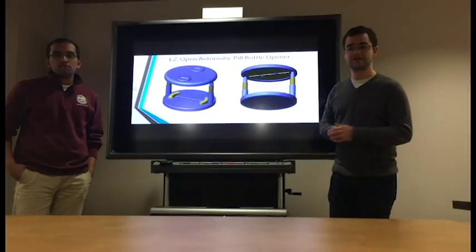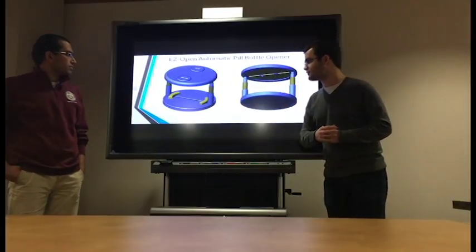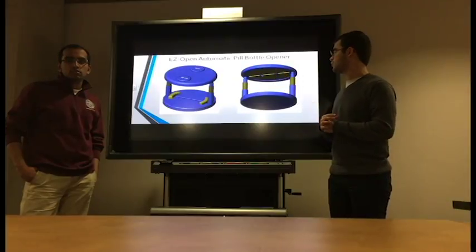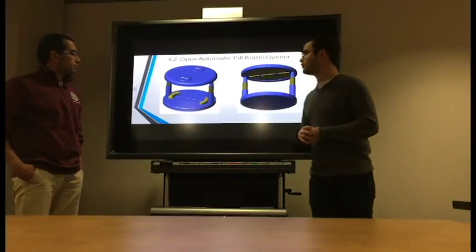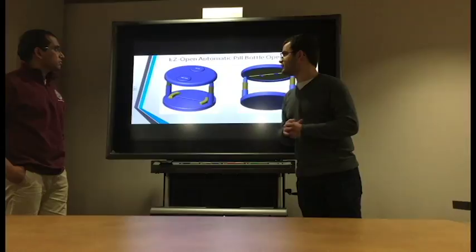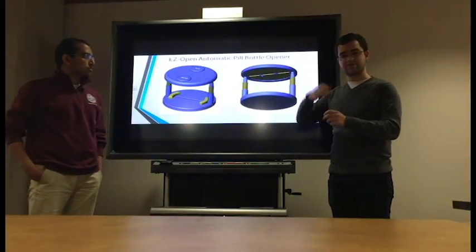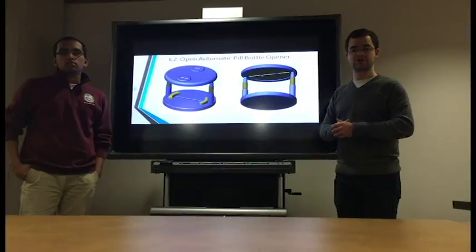After the user is able to access the contents of the bottle, since the cap will still be clamped at the top support shown here, the user will be able to apply the close function to the EasyOpen, which will lower the cap back down to the bottle and re-secure its child safety lock.